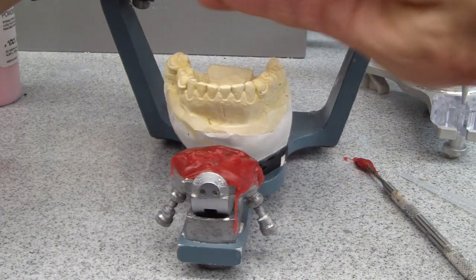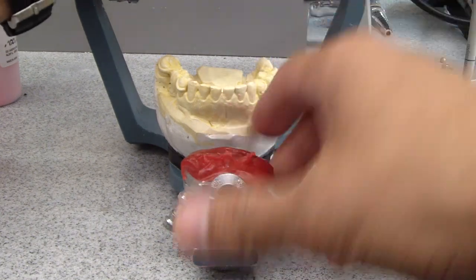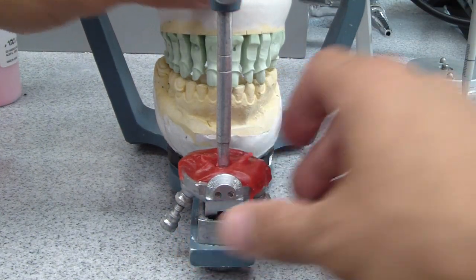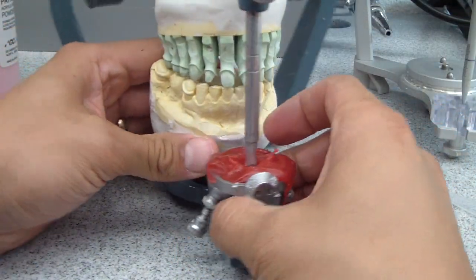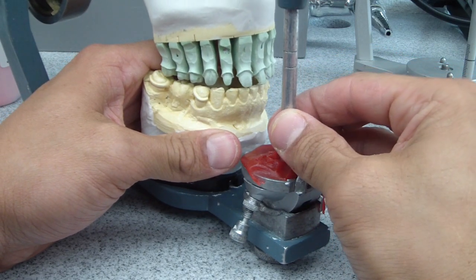So we have that with our provisionals — we have the custom guide table established. I'll clean and trim that up. Now when we go through our excursives, you can see that it's established just like what the provisionals had.